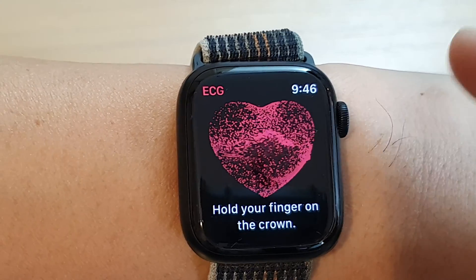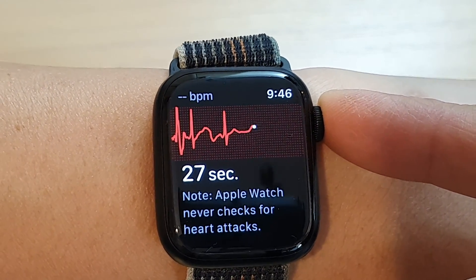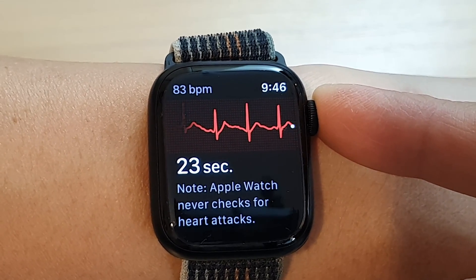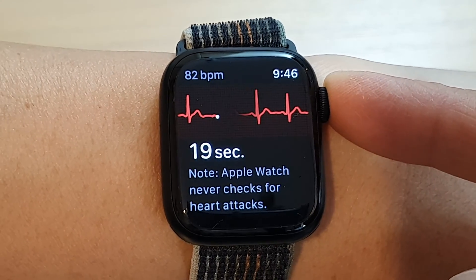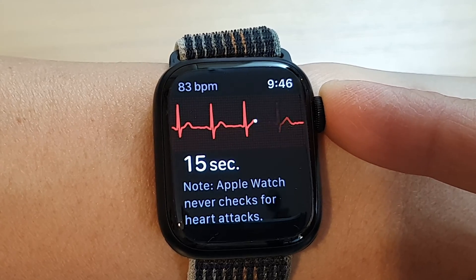It will say hold your finger on the crown. So hold like this — you don't need to press it. Just lightly or gently hold on to the crown button for 30 seconds. While doing this, do not move your hand around. Try to keep it as steady as possible.